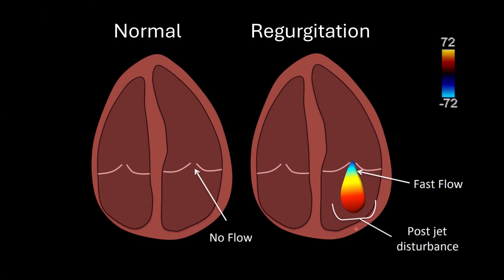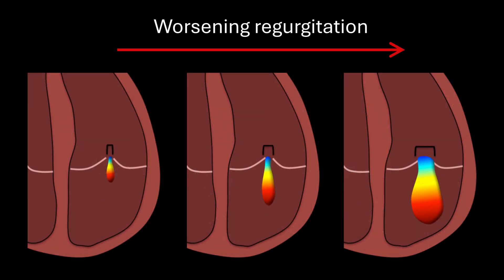Here's the appearance of regurgitation on ultrasound with color Doppler. Regurgitant jets will be fast and turbulent blood flow, so the regurgitant jet will appear bright and behind the valve. As the severity of the regurgitation worsens, the regurgitant jet fills more of the affected chamber, and the narrowest portion of the jet — called the vena contracta — gets wider. As a good rule of thumb, if the regurgitant jet looks like a small lighter flame, it's not hemodynamically important. If it looks like a flamethrower filling greater than 50% of the chamber with a wide vena contracta, it is likely hemodynamically significant.